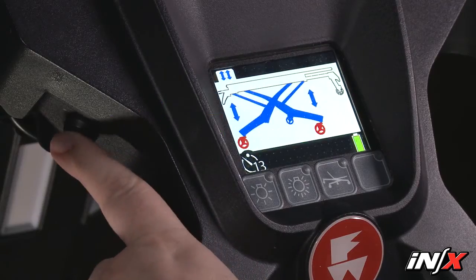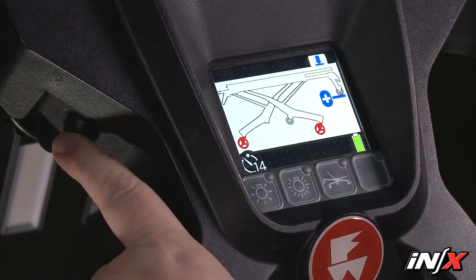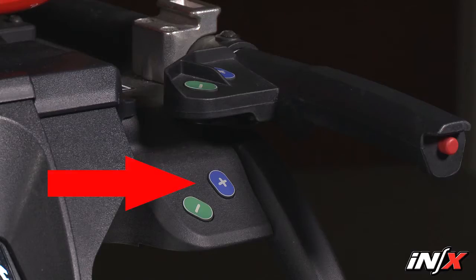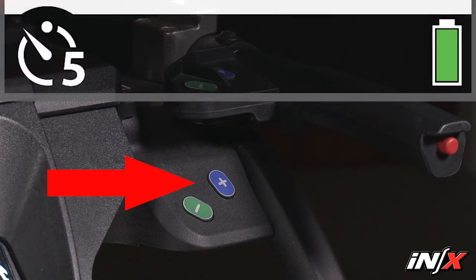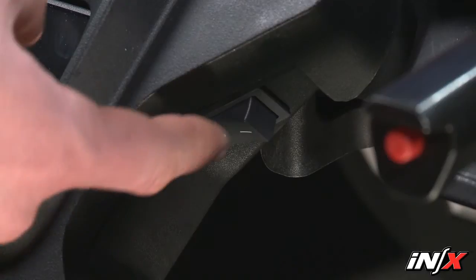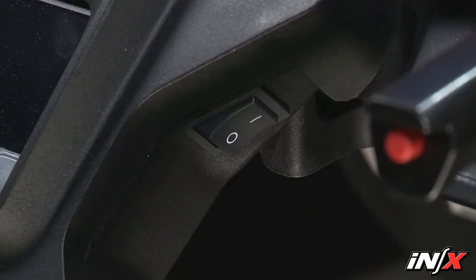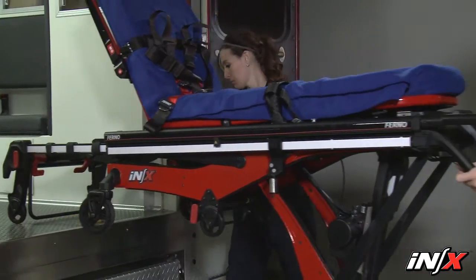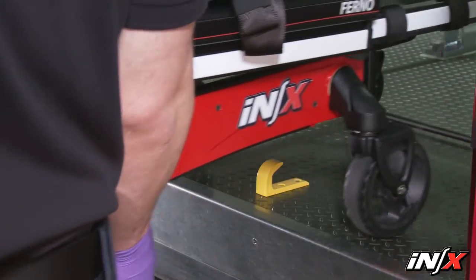Press the mode select button four times to enter the load height set mode. Press and hold the plus extend button before the timer expires, and continue to hold the button while the five second timer expires. Turn the power switch off, wait a second, and then turn the power back on to commit the new setting to the system's memory. Test loading and unloading to verify the NX stops at the new loading height.